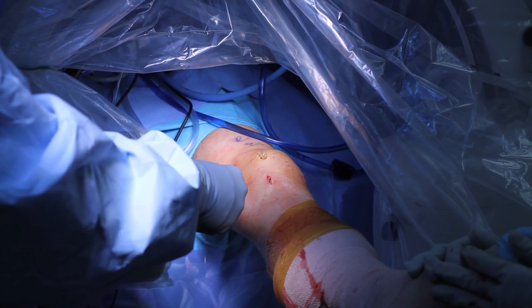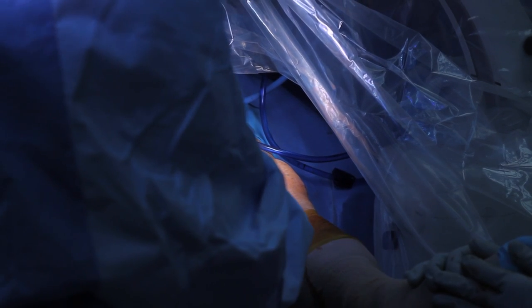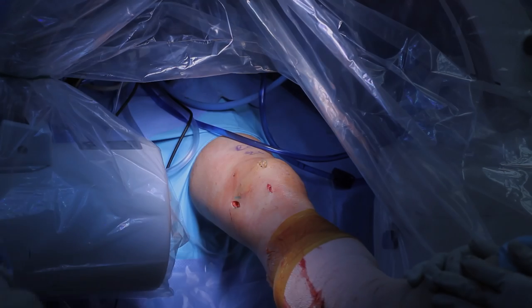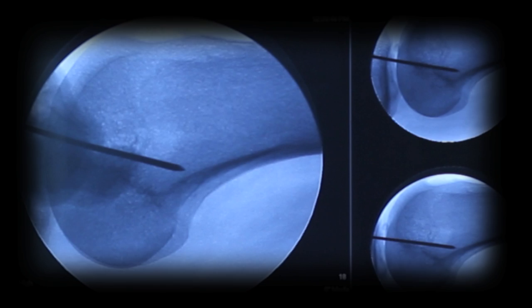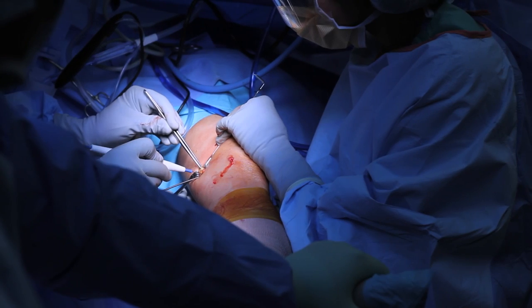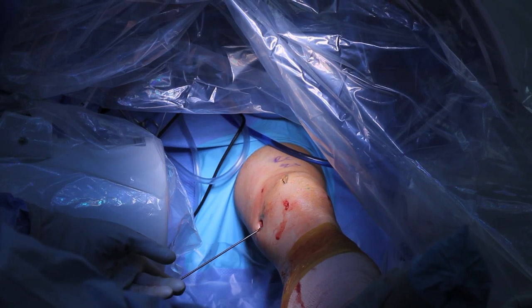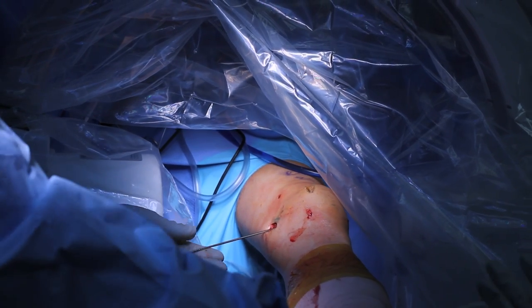It's very important to confirm the origin site of the medial patellofemoral ligament on the femur. To do this, I use a live X-ray machine. Here I am, identifying the origin site of this ligament on the distal femur. There's been some very elegant anatomic studies showing where this ligament originates on the femur, and I'm referencing these studies and placing this pin on the distal femur.